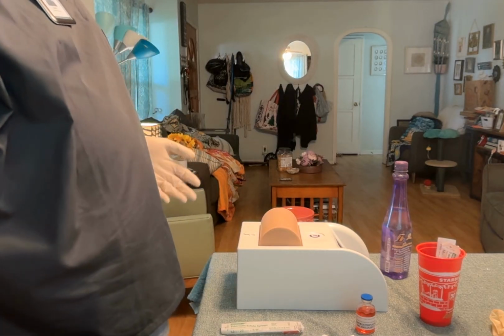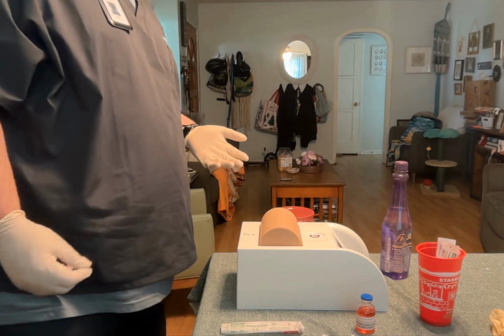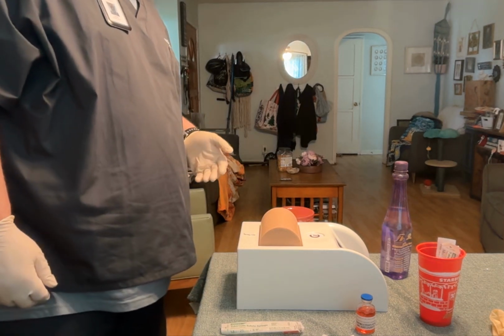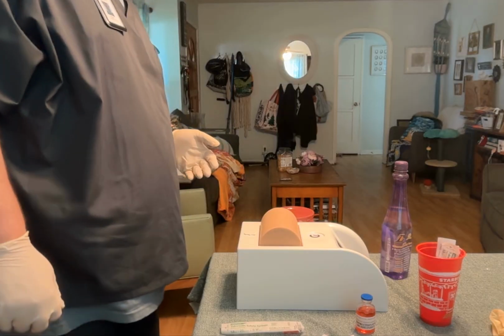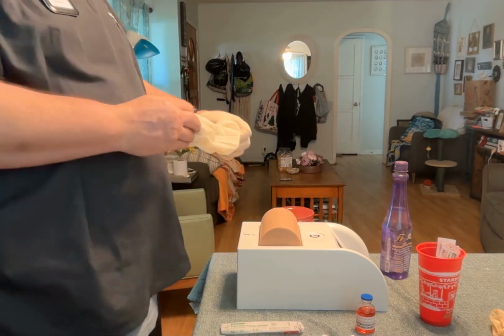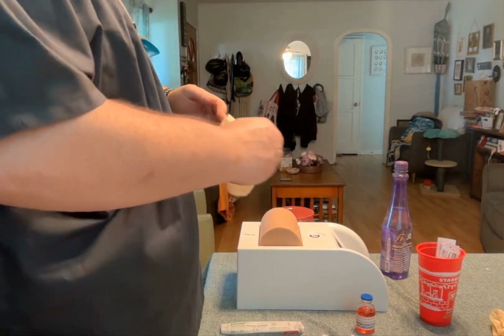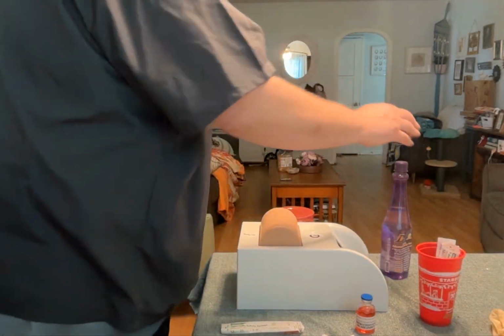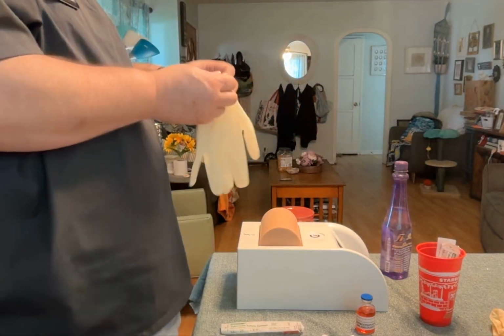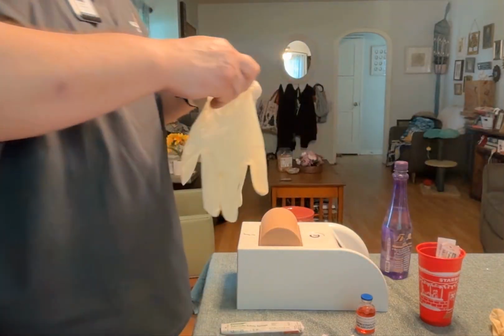I explained that with any injection, as normal, she might feel a slight stinging or pinch or burning at the site. She says she's aware, no problem, that she understands. And we say okay. So I'm going to discard my gloves now. Perform hand hygiene. Put on another set of gloves. And I'm going to start to prepare my medication.